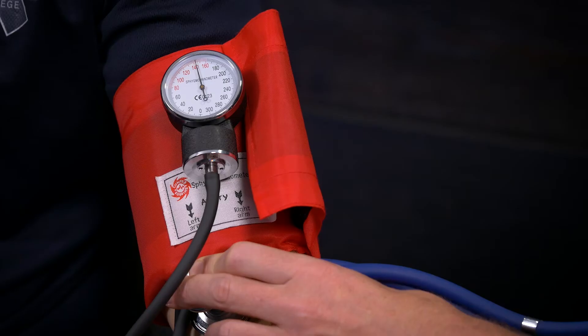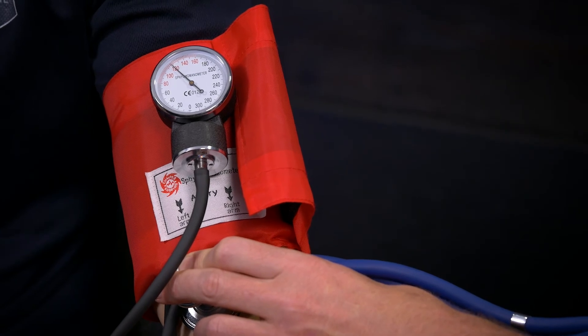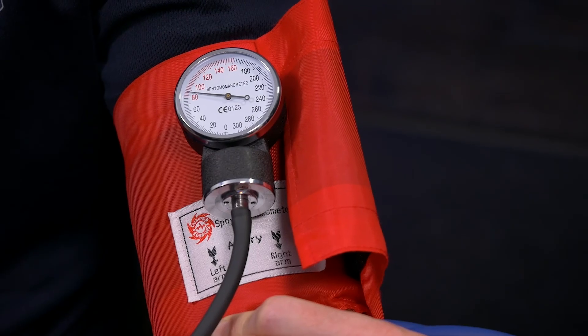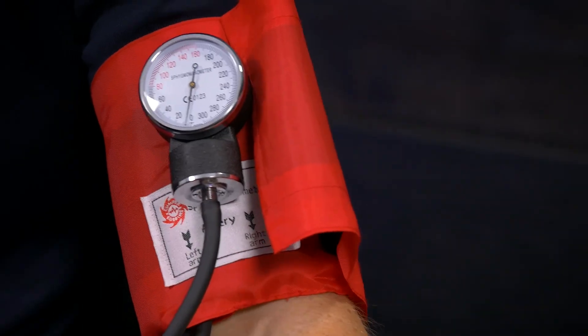I can hear Korotkoff sounds now, so I'll go a bit higher, and then again slowly come down. There they are at about 115 — they've resumed — and they disappear just there at 85. So that's 115 over 85 by auscultation. Deflate and take off the cuff. Everyone, thanks.